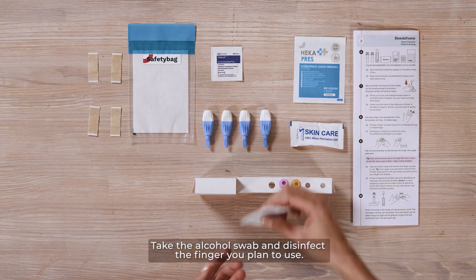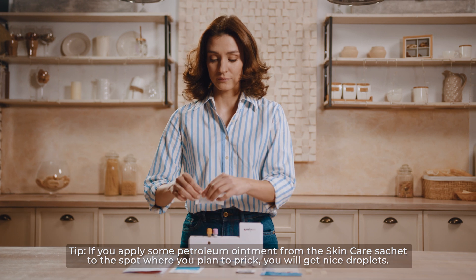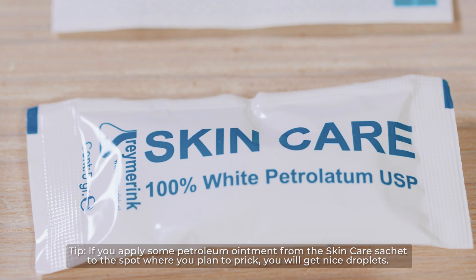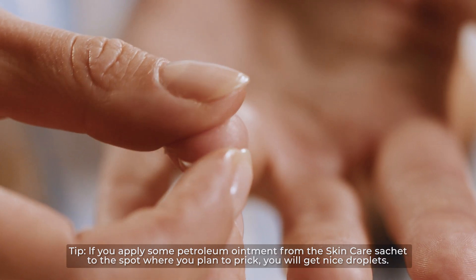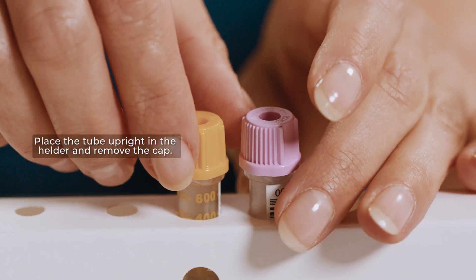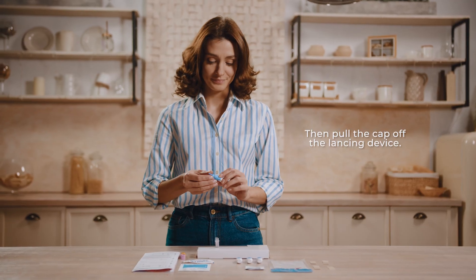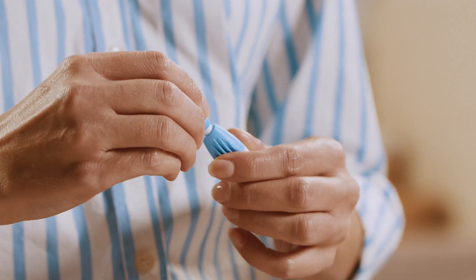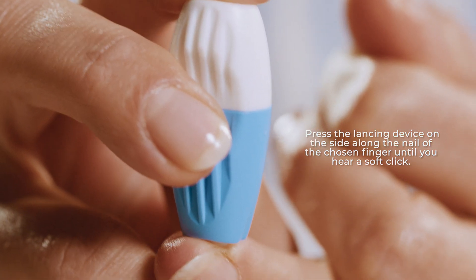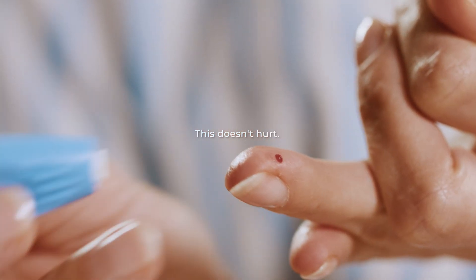Take the alcohol swab and disinfect the finger you plan to use. Tip: if you apply some petroleum ointment from the skin care sachet to the spot where you plan to prick, you will get nice droplets. Place the tube upright in the holder and remove the cap, then pull the cap off the lancing device. Press the lancing device on the side along the nail of the chosen finger until you hear a soft click. This doesn't hurt.